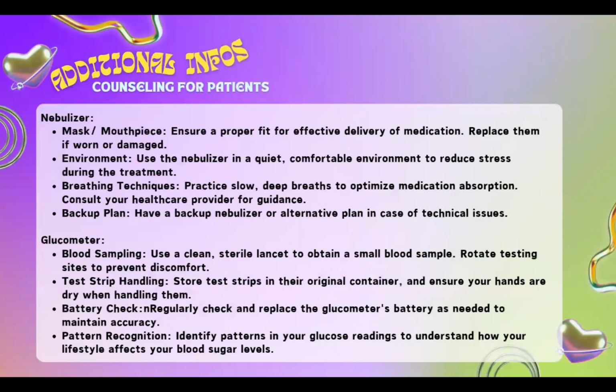And then counseling notes for nebulizer use. Ensure proper fit of the mask or mouthpiece for effective delivery of medication. Replace them if worn or damaged.